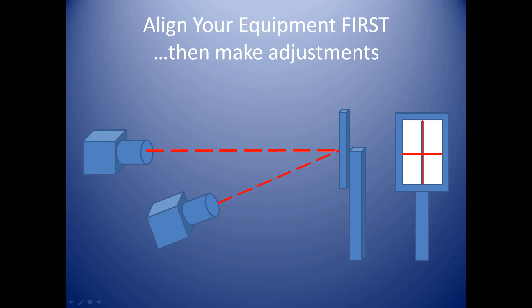This is a unique examination because we're using two different camera positions to acquire the images. We'll cover the AP view of the cervical spine first. This requires that you lower your camera and angle it upward toward the head 15 degrees.